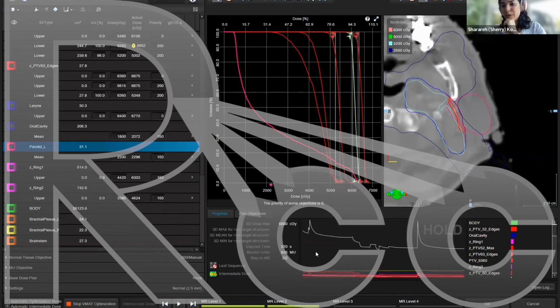Yeah, so does tissue density contribute in any way to the performance and results of the optimization? Not usually. There has already been a really nice lecture on tissue density and how that pertains to type B and type C algorithms. I won't go into all those details. It does make a big difference in terms of clinical value, but in terms of optimization, what you see is what you get. It won't have an issue on optimization.